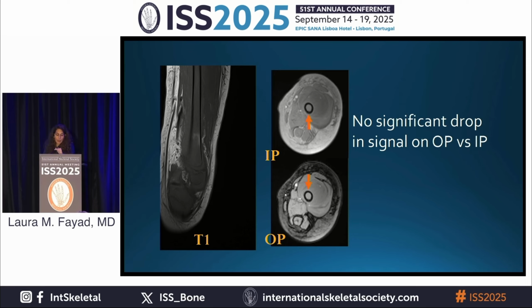It's a little bit different between 1.5 and 3T, but 20% is a good number to remember. So less than 20% is positive, and over 20% is negative for marrow replacement and means that you're dealing with red marrow or reactive edema, for example. And usually if you have red marrow, it's much higher than this, like 50, 60+%.